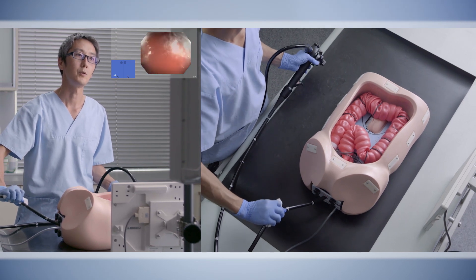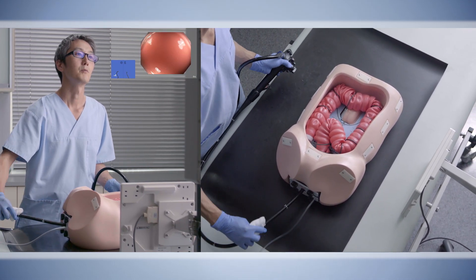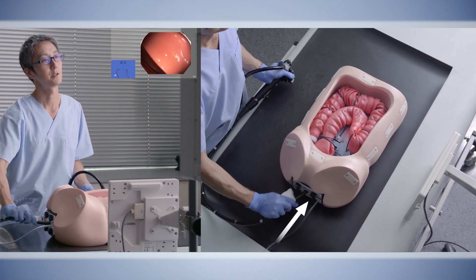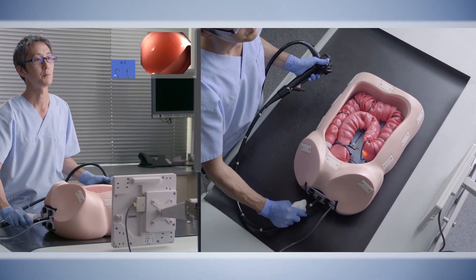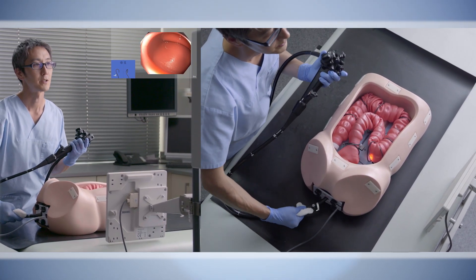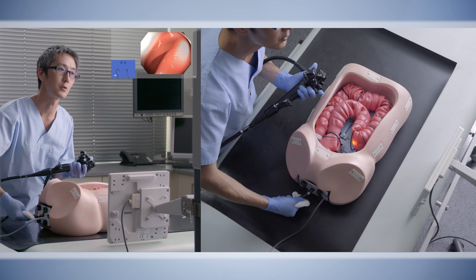We'll show you the loop. After we pass the sigmoid top, we gently push the scope tip until we reach the sigmoid-descending junction. After we reach the sigmoid-descending junction, with sufficient right torque, we gradually take out this small loop that we formed in the sigmoid colon.